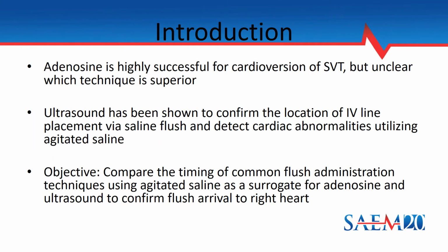As a background, adenosine is highly successful in terminating SVT. It is vital that the adenosine arrives to the heart quickly, as its half-life is less than 10 seconds. Multiple techniques exist for adenosine administration, but little is known about which may be superior.